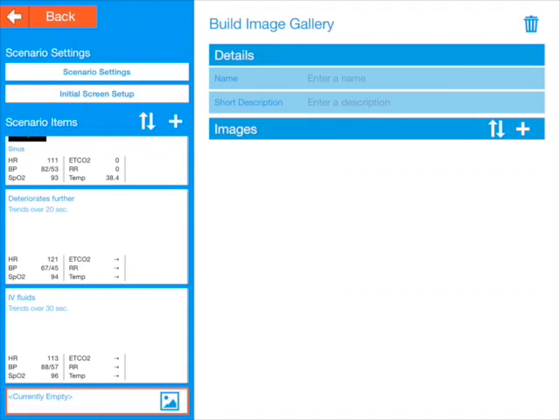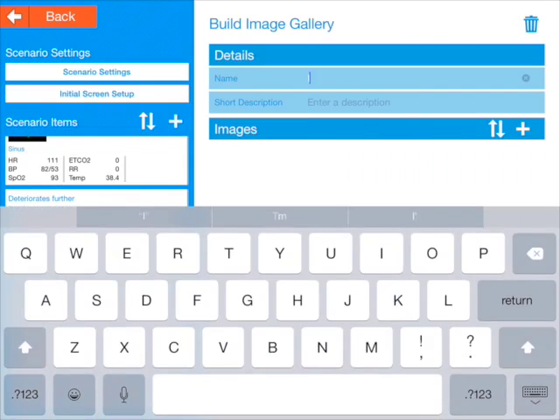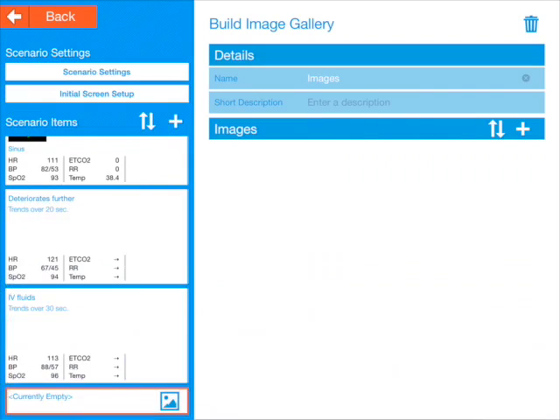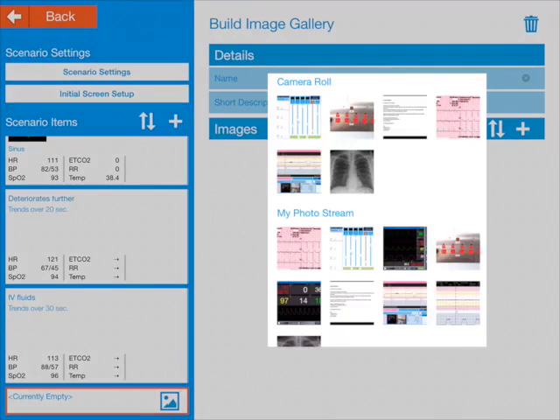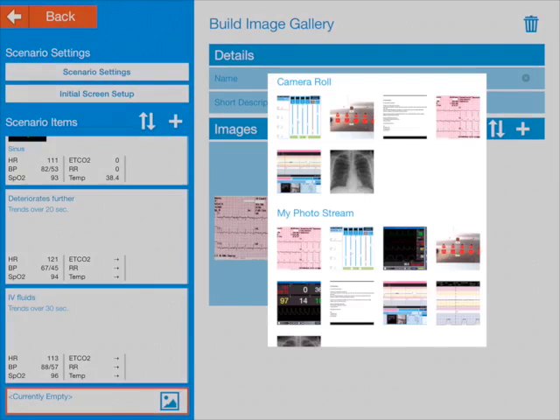So in the image gallery, we enter a name — you have to do that. I'm just going to call it 'Images.' A short description is optional. Under images, you press the plus button. Here we are in the camera roll and photo stream if you have that enabled on the iPad. You can see a few images there — let's add an ECG and let's add that chest x-ray as well.